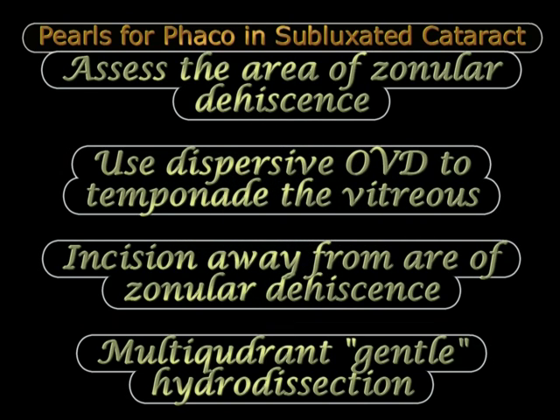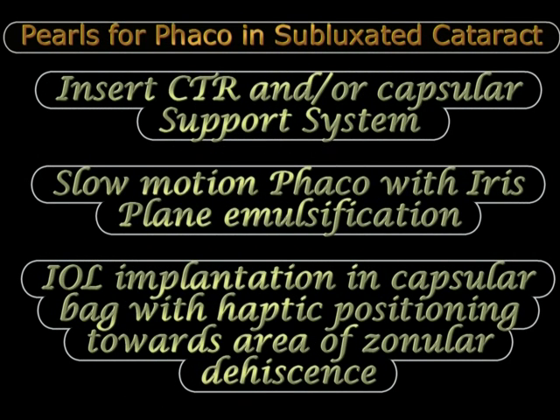These are the pearls for performing phacoemulsification in subluxated cataracts: assess the area of zonular dehiscence and choose the device or technique accordingly. Always use a dispersive viscoelastic like Viscoat to tamponade the vitreous. The incision should be placed away from the area of zonular dehiscence. Multi-quadrant gentle hydrodissection is a must to loosen cortical fibers so we don't need to pull on them and risk enlarging the area of dehiscence.